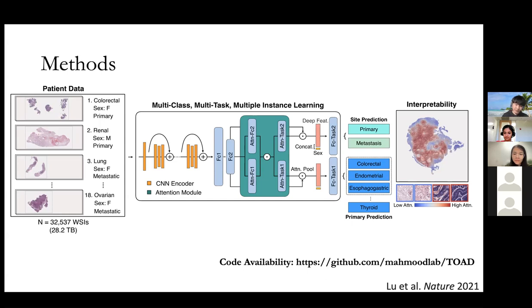And for things like transformers, I'm not that familiar with the state of the art in terms of how it's applied to computational pathology specifically. I've read some papers, because the bags in your whole slide images are so big, right? The quadratic cost will just kill you if you try to use a transformer on it. So people typically use Nystrom approximation or linear transformers to do some kind of approximation instead of using the vanilla self-attention. But I feel like people haven't really empirically validated how accurate those approximations are in the context of computational pathology. So it's interesting.